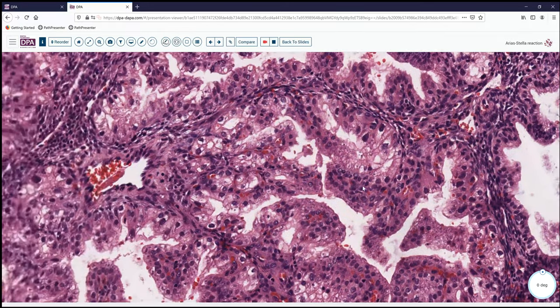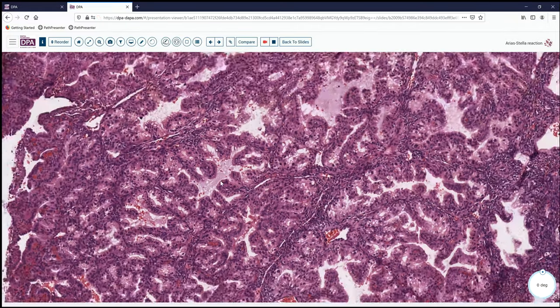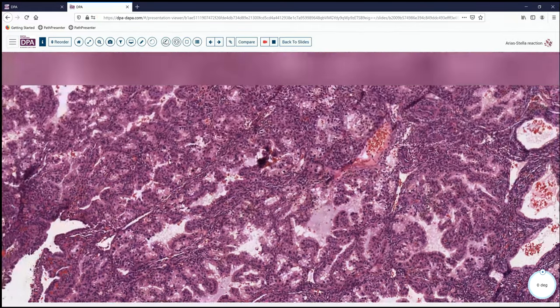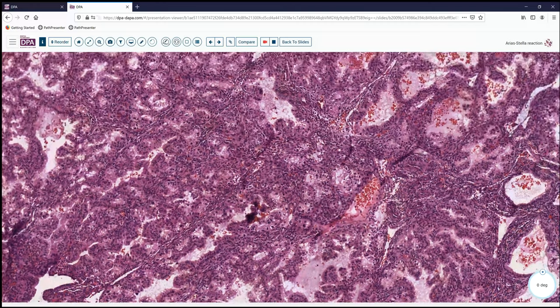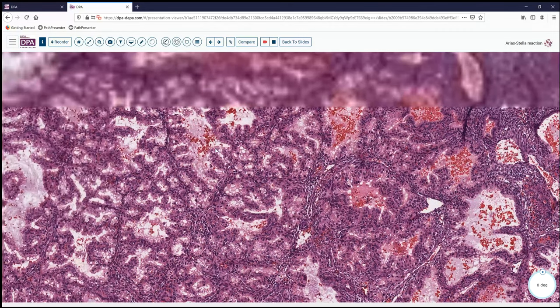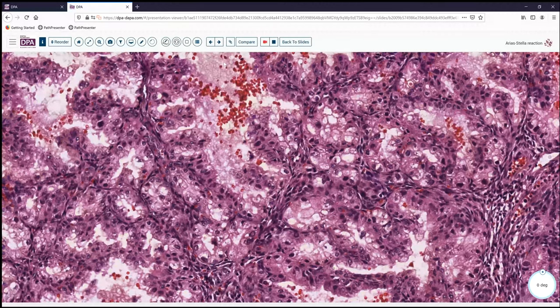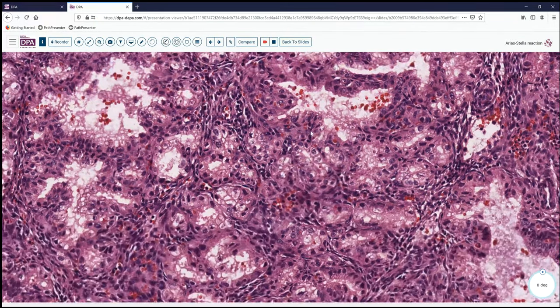The resident who brought this case to me wondered if this was a secretory hyperplasia. Well, this is a great example of a hypersecretory endometrium that can be seen in patients who are undergoing a dramatic shift in their hormonal status and have the concomitant changes happening in their endometrium without any significant progestational impact on these glands. This is a wonderful example of an Arias-Stella reaction or hypersecretory endometrium.